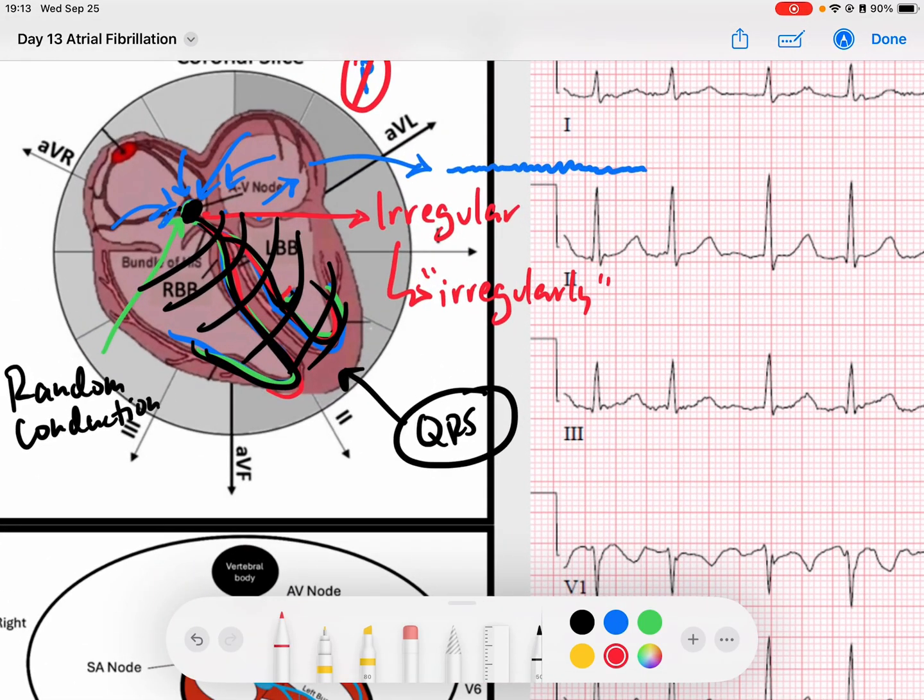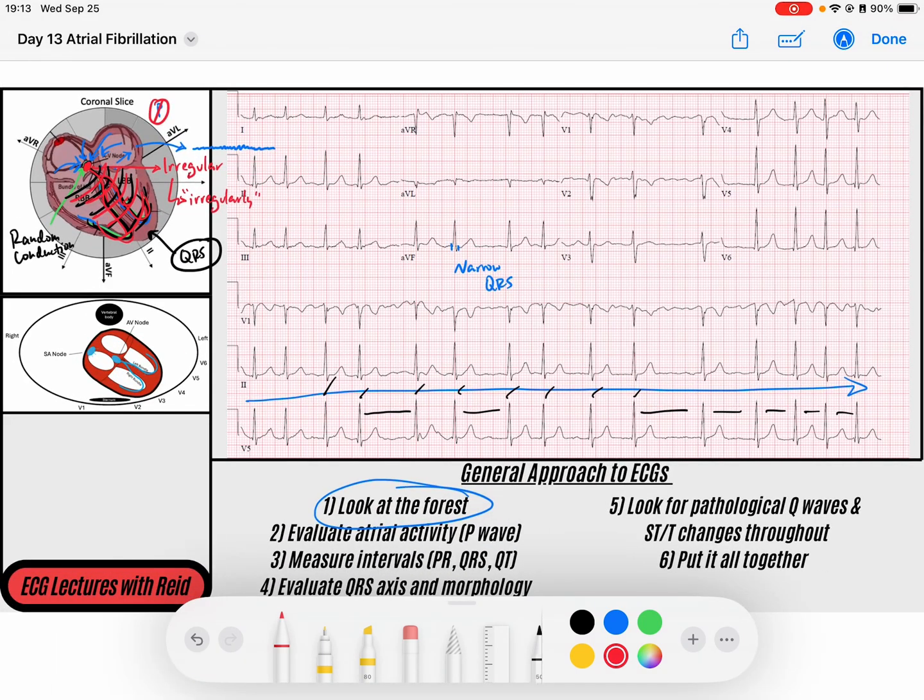I know that my QRSs are being generated from my AV node. Remember that the AV node, when the AV node sends signal down to the ventricles, it does so via this His-Purkinje fibers that sends rapid signal through the ventricles. A narrow QRS means that the rhythm is being generated at least at the level of the AV node or higher.